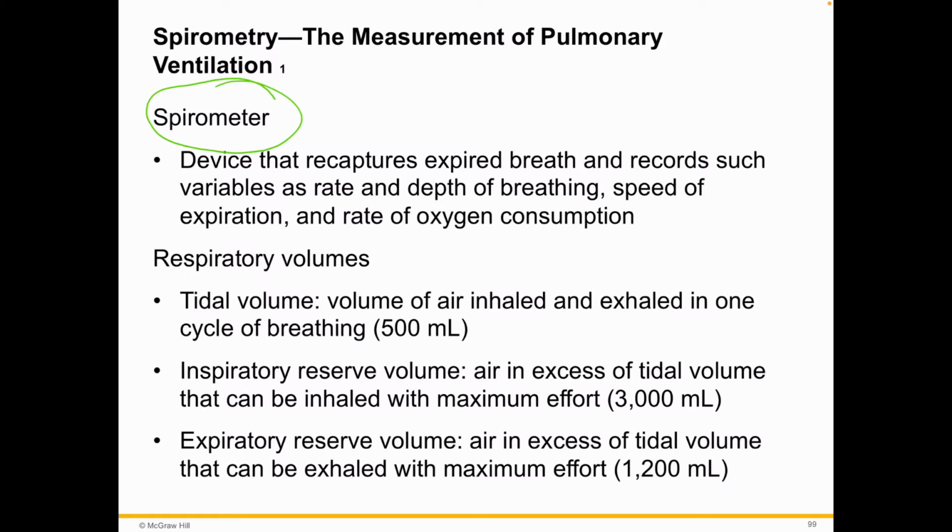They do a few things. They allow you to measure a couple of variables. Like you want to time it, you want to count the amount of breaths. It allows you to determine the depth of breathing. So if you're timing it, the rate also as well. So that can also help you understand a little bit more about the rate of gas exchanges in the body.